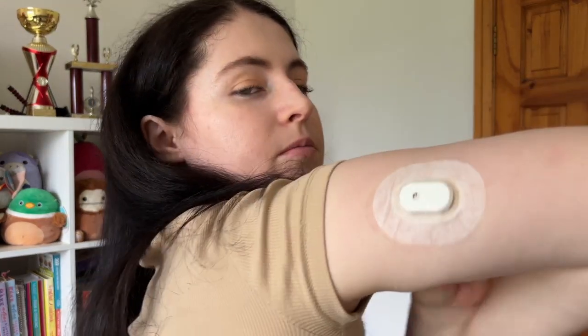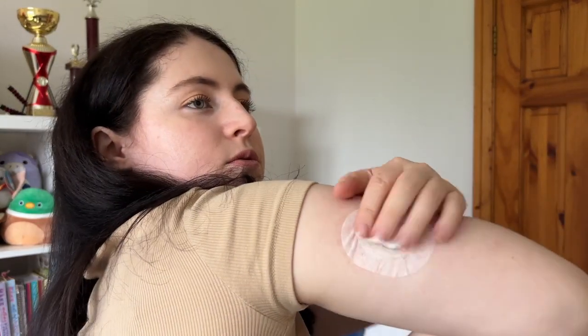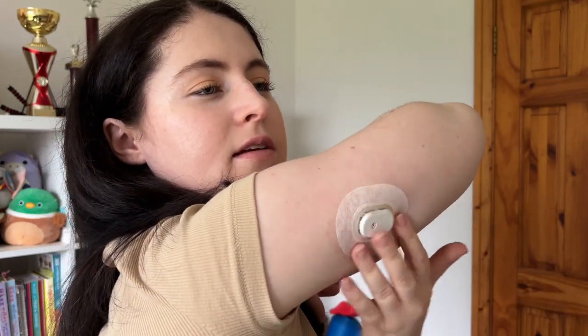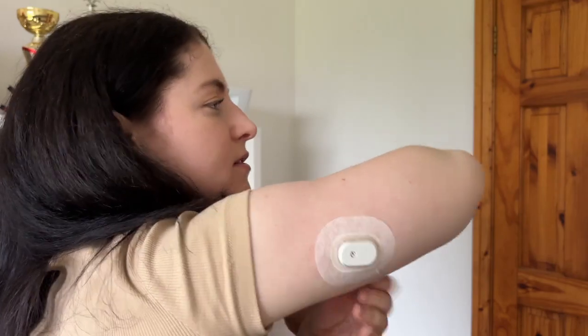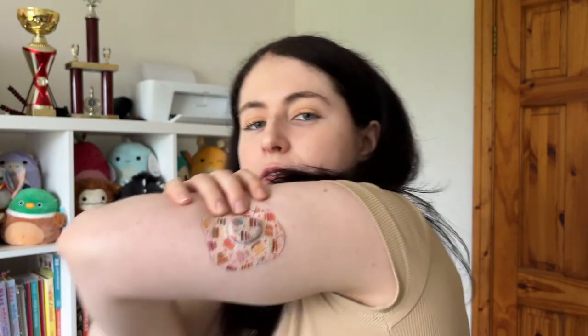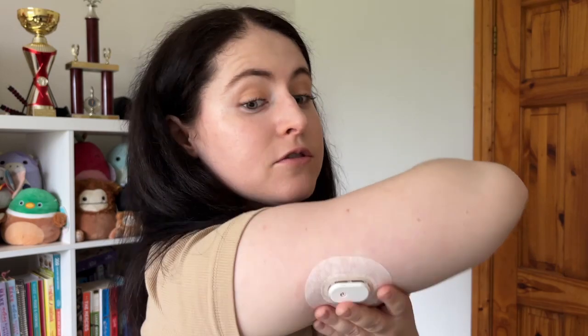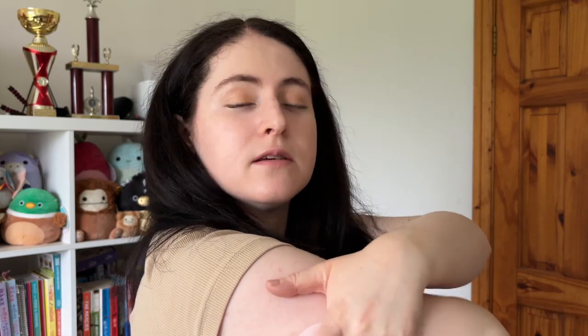I have the overpatch on. I do really like how sturdy the overpatch is and it's big — like a Dexcom G6. This is definitely bigger than the G7 that I have here. I am surprised that the first one was a bleeder. The needle looked big in the applicator — I'm wondering if it's bigger. I must look that out for my second video.